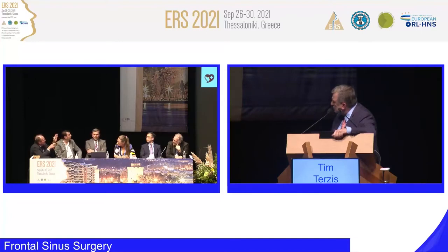So this prescribes a little bit more precisely how we access the frontal sinus. So I agree, drill out, makes sense. It depends how much you remove, and then you have your grading. And this has to be documented. And I think it's of high value to speak with one language when we do surgery. Okay.